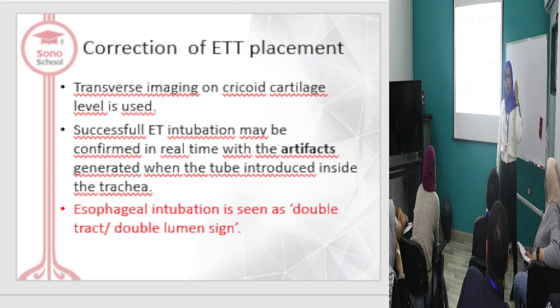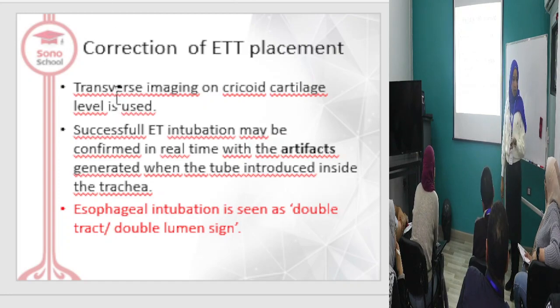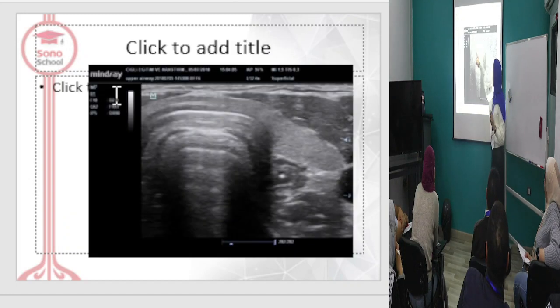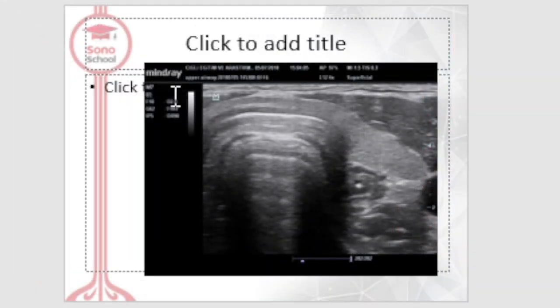Do you remember yesterday's physics lecture? Yes. This is trachea rings. No airway column outside. Air column. This is a better image. This is the endotracheal tube in place in the trachea. Trachea rings, then the tube of air.